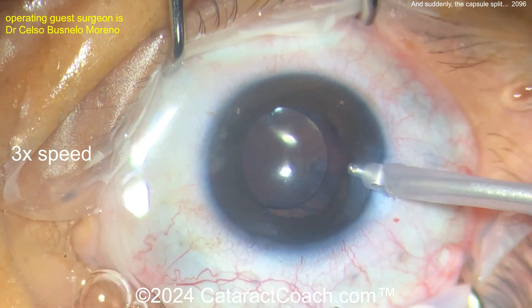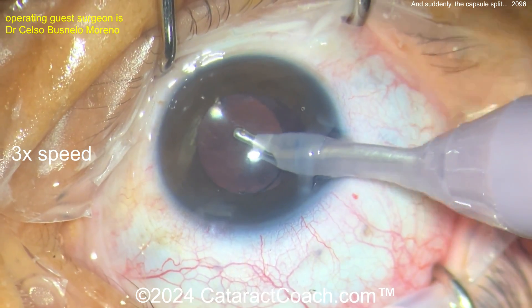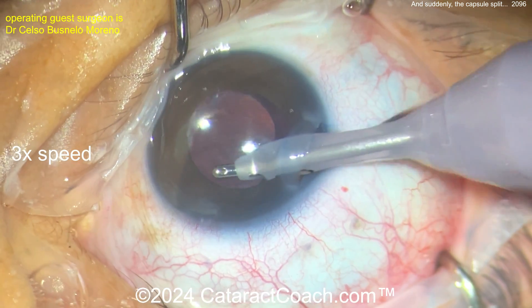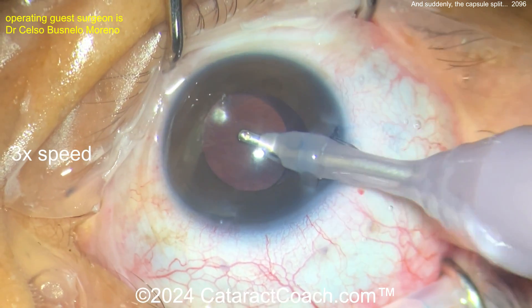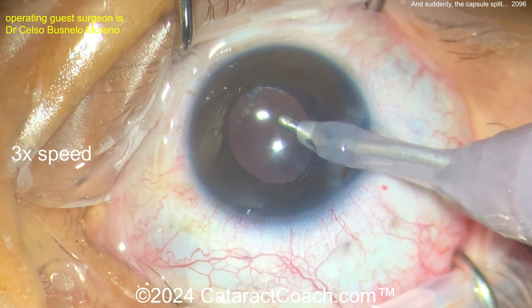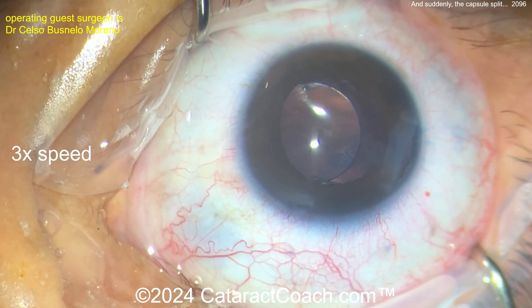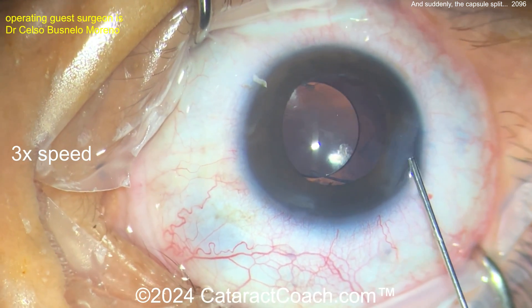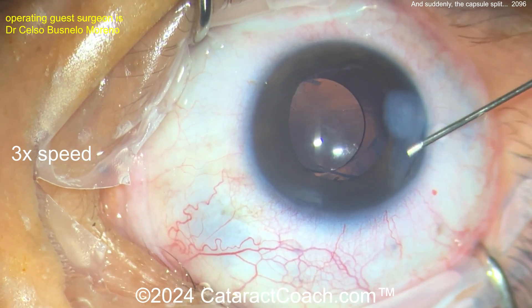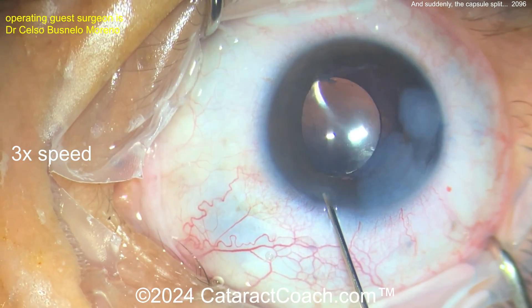With the lens in — looks like sulcus placement — a little bit of capsule cut with scissors. Using the I/A probe to take out the viscoelastic. I'd make sure that lens is a bit better centered, but this is a stressful case. I want to commend the surgeon — beautiful job recovering from a stressful situation. Probably the most important thing was: once that Argentinian flag sign appeared, the surgeon put the chopper in the eye and brought that nucleus up into the anterior chamber.